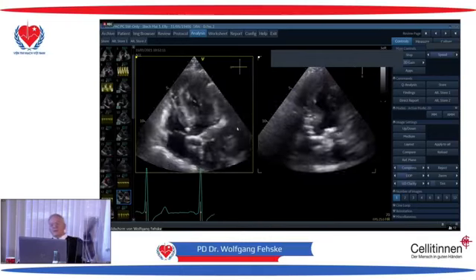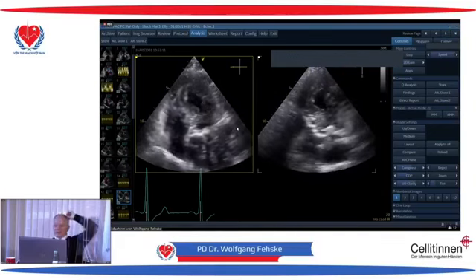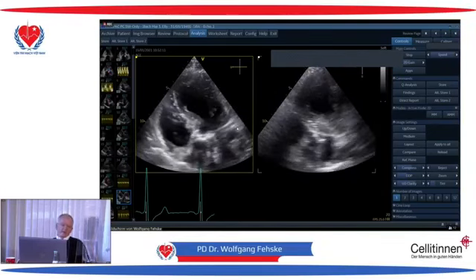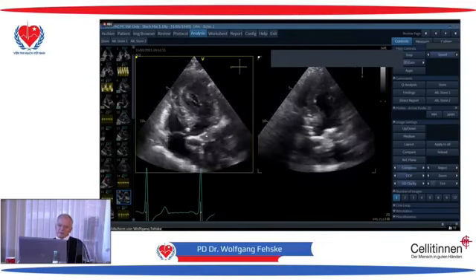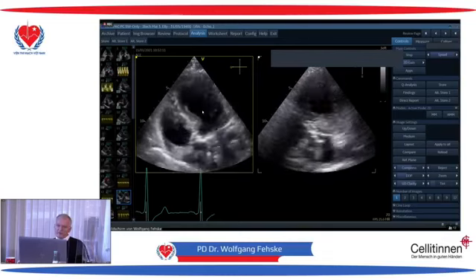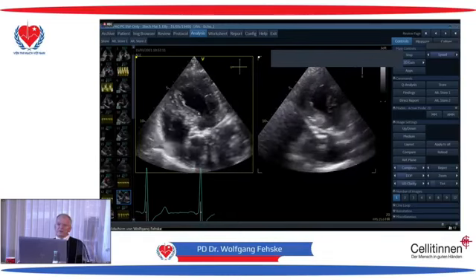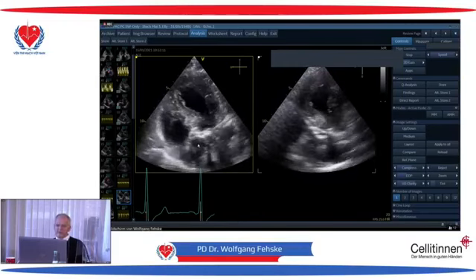And when you explained about the TAVIs in bicuspid aortic valves or whatever, you must look for a coaxial position of the TAVI in any way, or whatever you do with surgeons also. But this is not a very well suited situation to replace the aortic valve here.